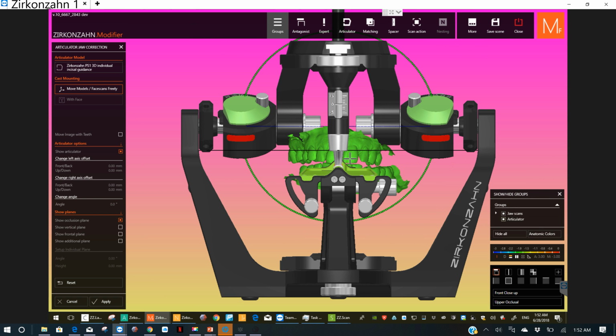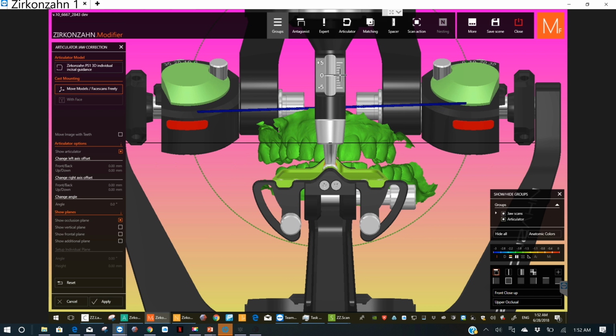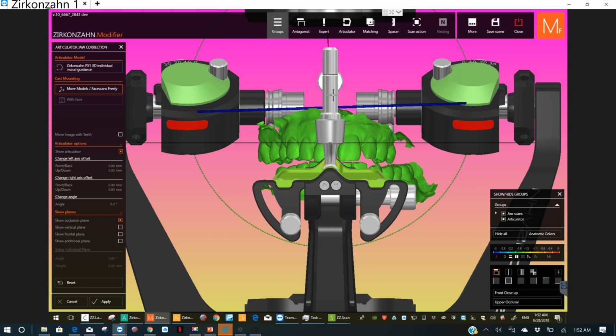Go check it out, see how we did. Gosh, it's hard to believe. Cheat a little bit that way, so it's not too true. Hold down Control, and you can make things disappear that are in your way, or you can go turn off right here.